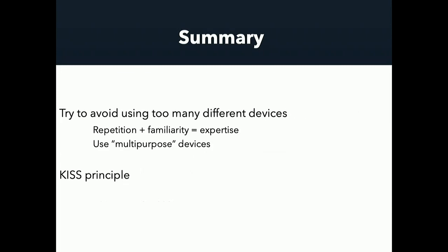Again, try to avoid using too many devices, and I think that's particularly apt for low volume centres, particularly if you're not doing many aneurysms. It's really important you stay familiar with a few devices and use multi-purpose devices wherever possible, and keep it simple wherever possible. And I think our colleague from Shanghai yesterday summed it up beautifully.